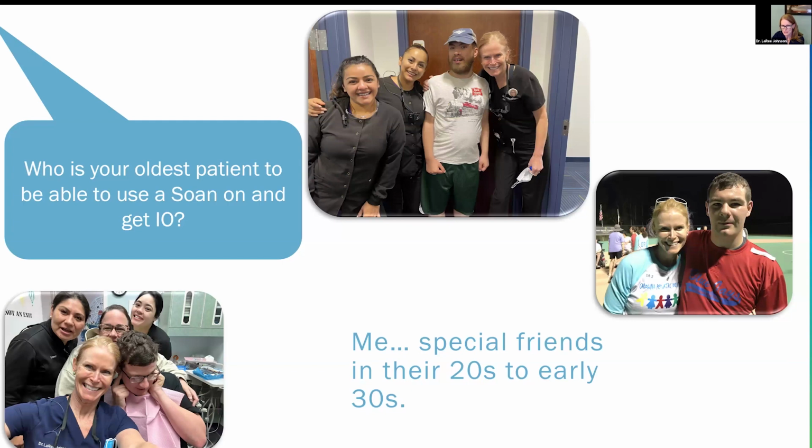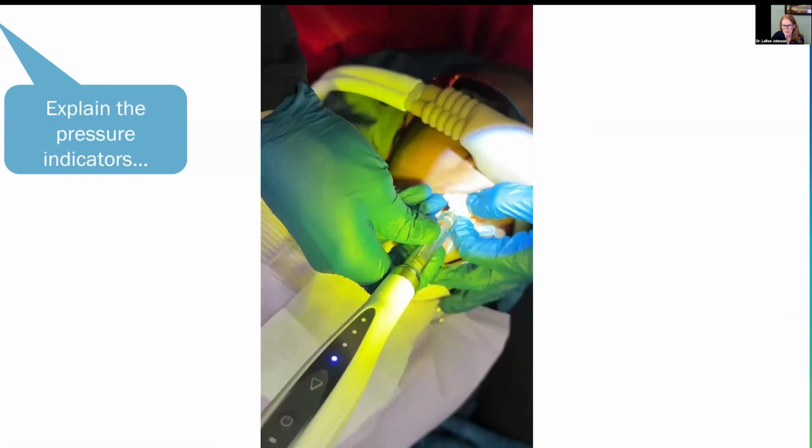How old can you use these? You can use them on everybody. Routinely use them on grown-ups.